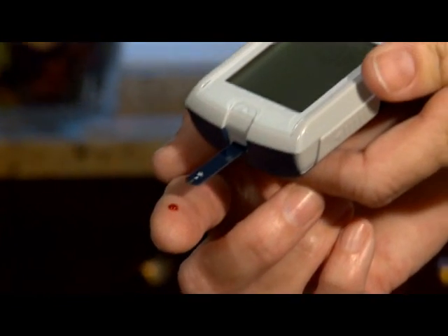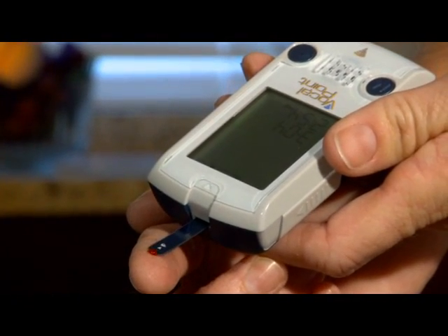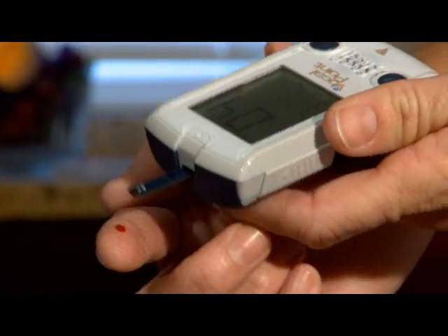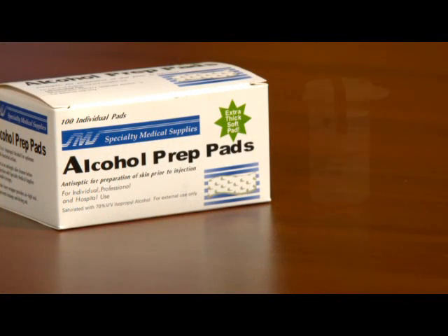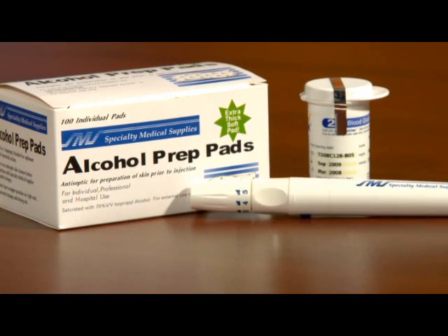Performing a blood glucose test is as easy as one, two, three with your Vocal Point blood glucose monitor. To perform a blood glucose test you'll need the following items: test strips, lancing device, lancets, and tissues.